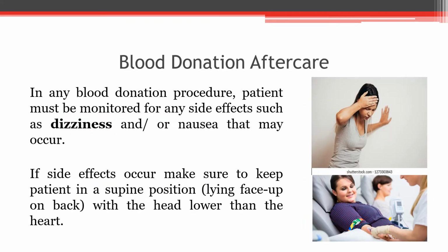Blood donation aftercare. In any blood donation procedure, the patient must be monitored for any side effects such as dizziness and/or nausea that may occur. If side effects occur, make sure to keep the patient in a supine position, lying face up on the back, with the head lower than the heart.